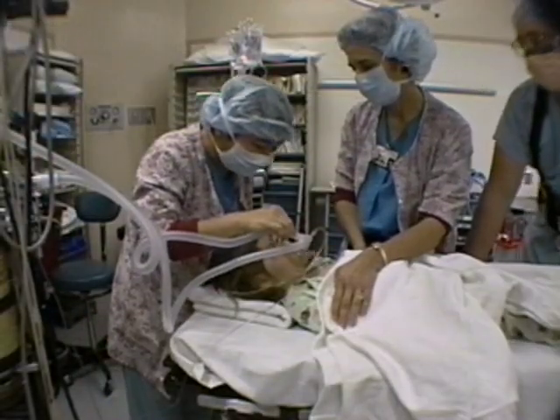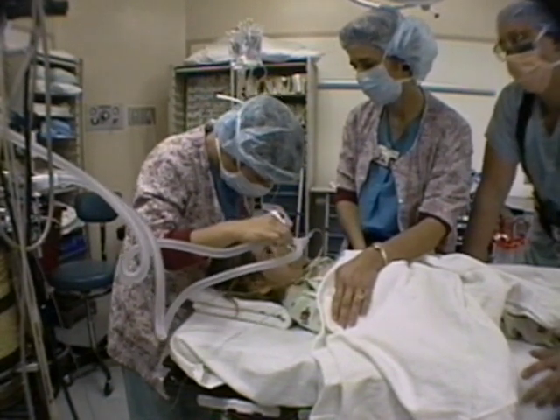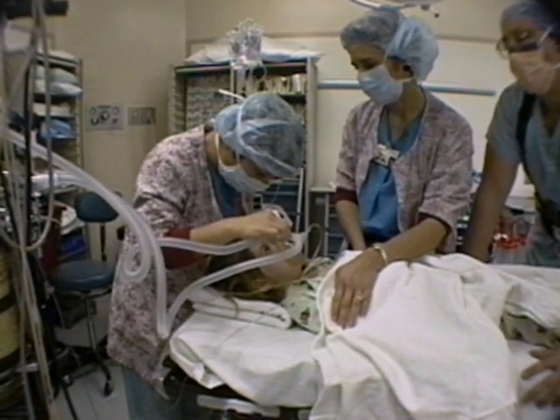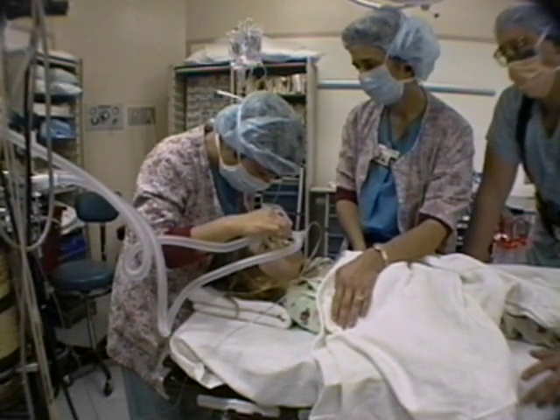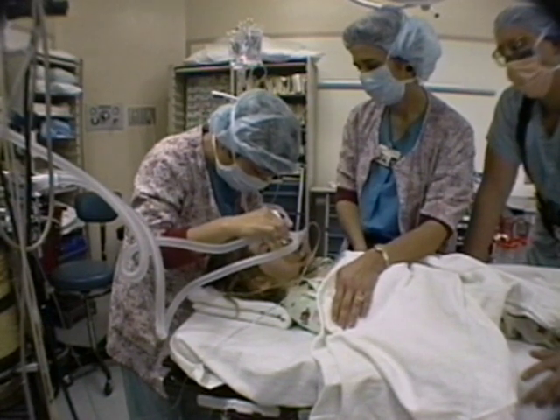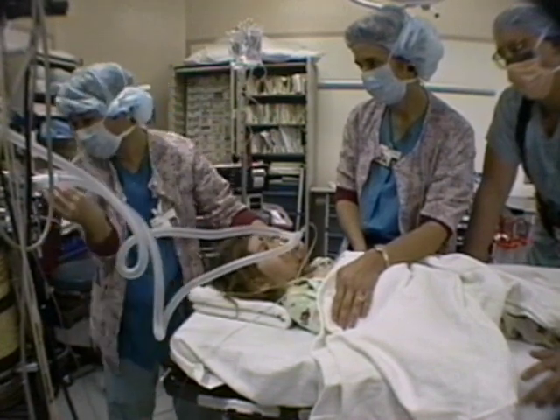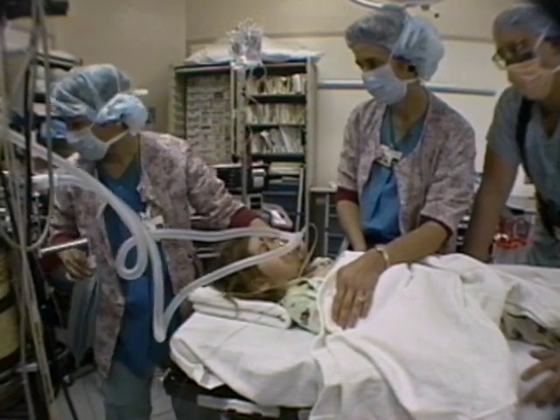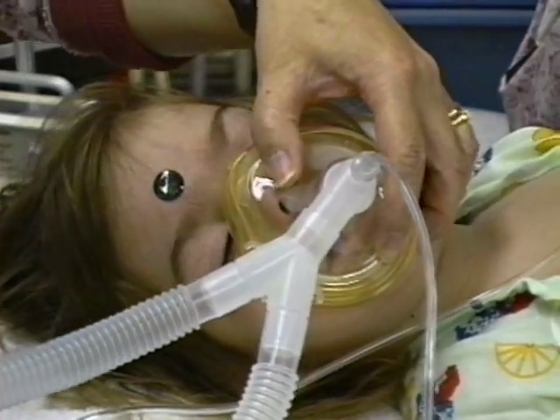Partial upper or lower airway obstruction alters the mechanics of breathing. Let's look at a patient to see some of these physical signs of obstruction. This 7-year-old girl is about to undergo tonsillectomy for enlarged tonsils and sleep apnea. She's breathing an anesthetic gas. As she loses consciousness, her muscles relax and she starts to obstruct her airway. Watch how the mechanics of her breathing changes.